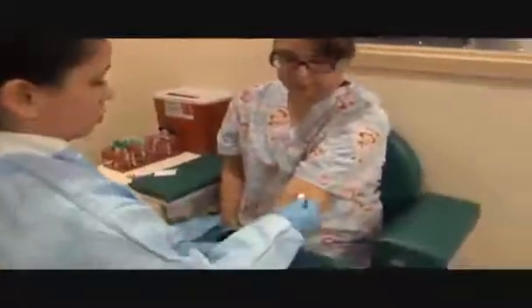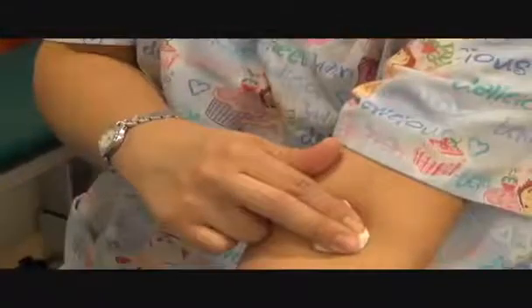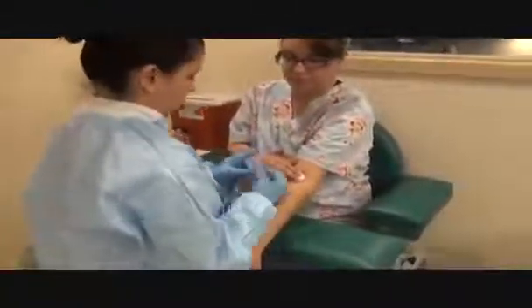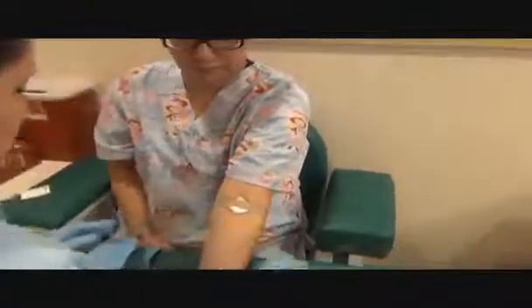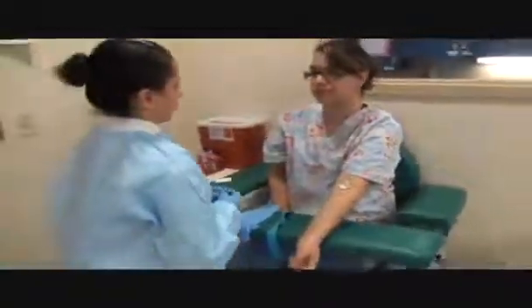Are you on any blood thinners? No. Checking the site, making sure it's done bleeding. Please apply pressure. Because the patient's not on any blood thinners, I'm applying a bandage or tape depending on the site. Giving the patient instructions: please leave the bandage on for 15 to 20 minutes and no heavy lifting for two hours.